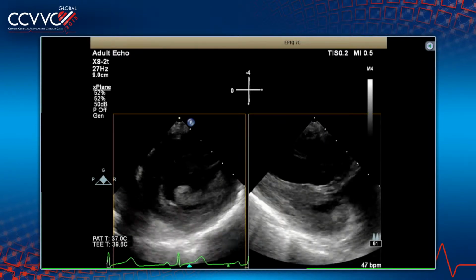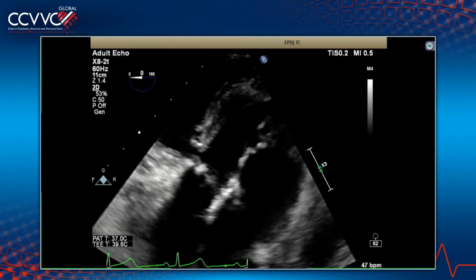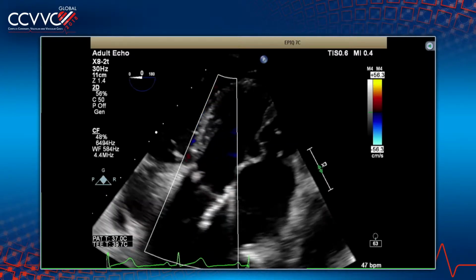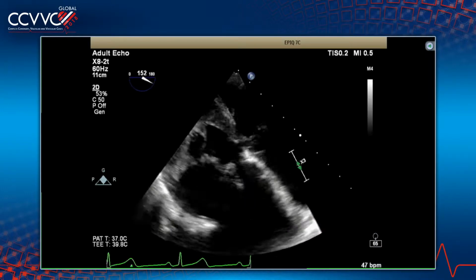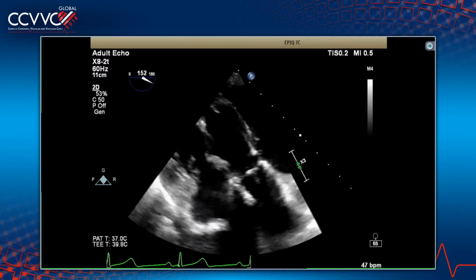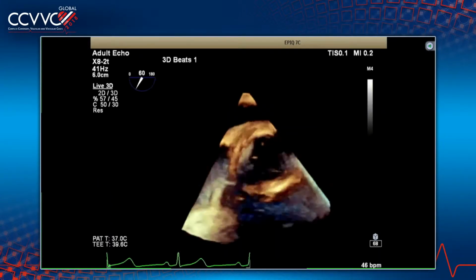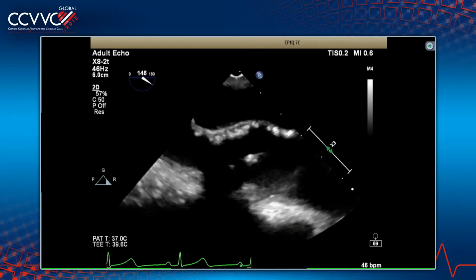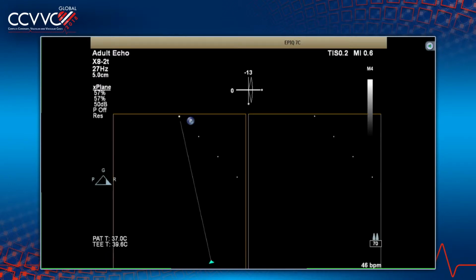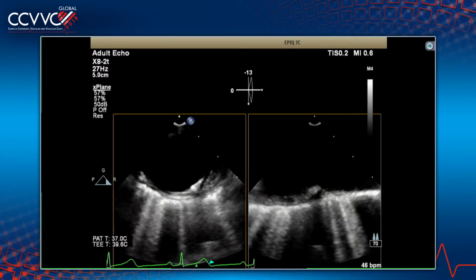Yeah, so here we see that the patient has severe LVH, normal LV function. We have a look here at the aortic valve. You can see that the leaflets are thickened, and there's very turbulent flow. The gradient that we measured under general anesthesia and transesophageal is a little bit lower than what we had on transthoracic. She has a mean gradient of 44 on her transthoracic with a very high velocity. Again, another look at the valve showing calcific leaflets. On her mid-esophageal view, again, LVH, normal LV function, only mild MR. You can see the calcification in the valve on the 3D view of the aortic valve, and again the limited motion of the leaflets. She has only mild to moderate plaque in her thoracic aorta. So, yeah, she's a good candidate.